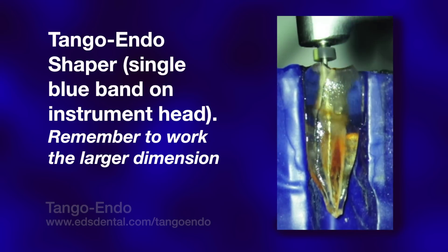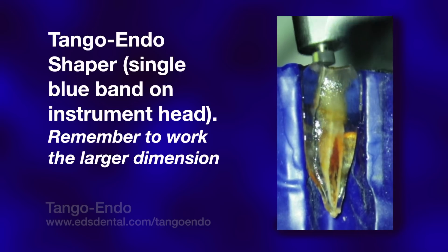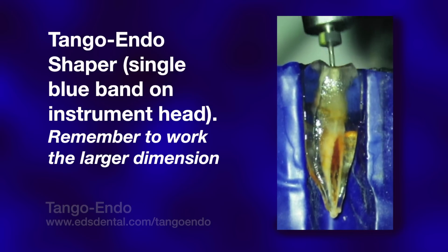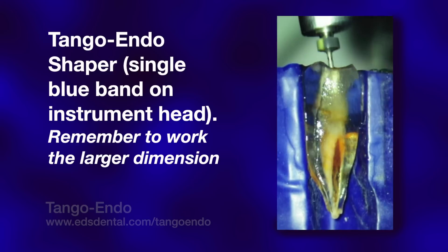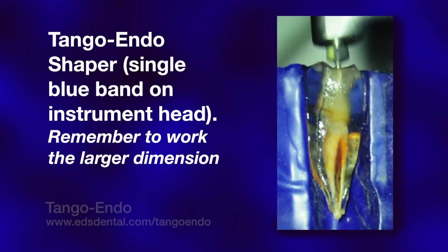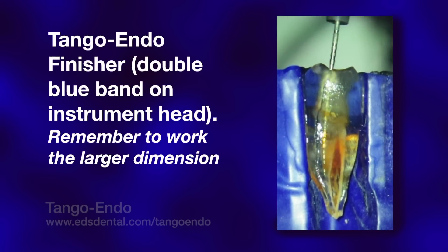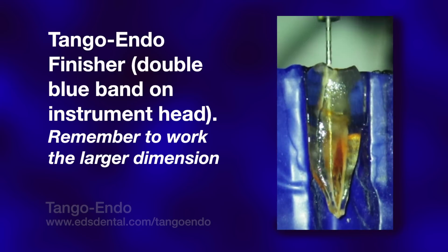One might ask why we have two different reciprocating handpieces. The safe-siders are made mostly from twisted stainless steel and are highly resistant to breakage even when overly rotated; they can be used safely both manually and in the reciprocating handpiece. The Tango-Endo instruments are made from machined stainless steel and nitinol and, if overly rotated, are subject to breakage. By confining their use to a latch-type 45-degree reciprocating handpiece, they cannot be overly rotated and will remain intact.